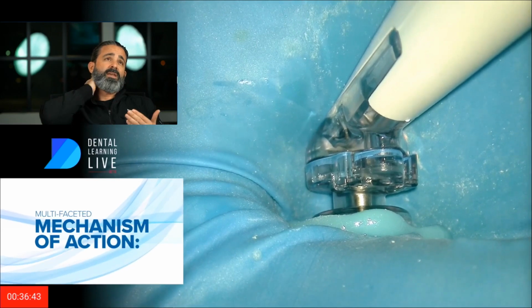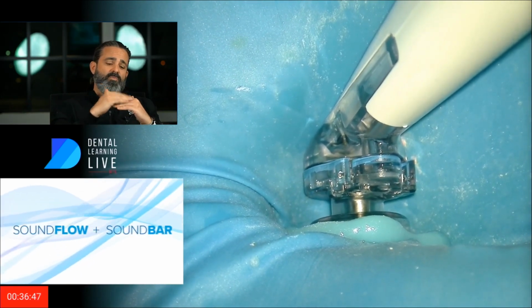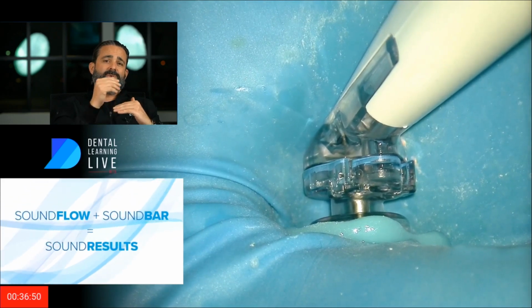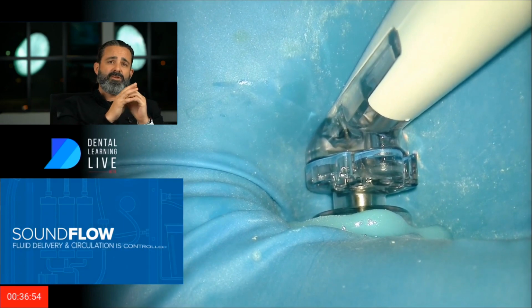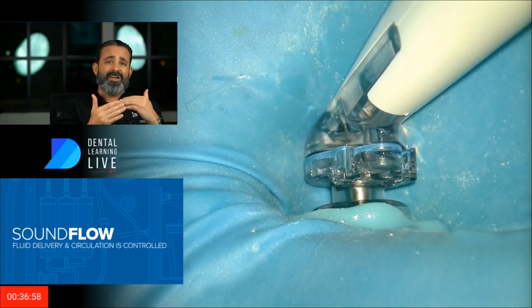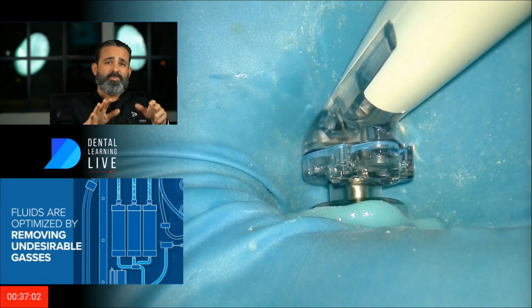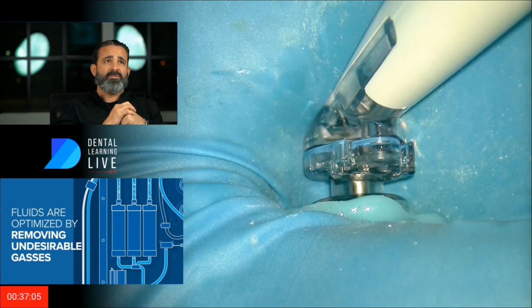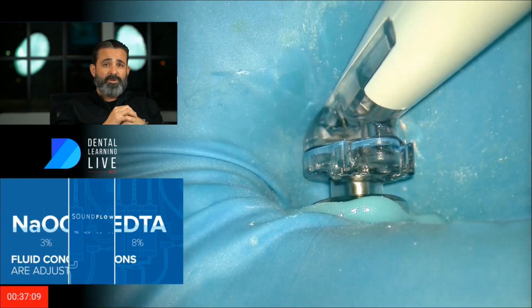So for me, I'm always a patient comfort guy first. And I'm also heavy-handed when I measure by design, because I'm pushing on the platform that I created with the Sound Seal. I want to know if I can dislodge it right now myself. Because if I see any micro movements going on under the microscope, I abort. I don't want to use that platform anymore. I'll rebond it. I'll figure out a hack to do that, but I don't want to do that.